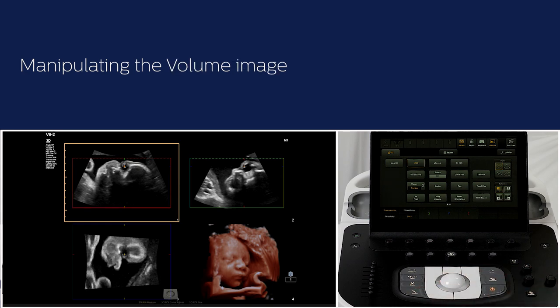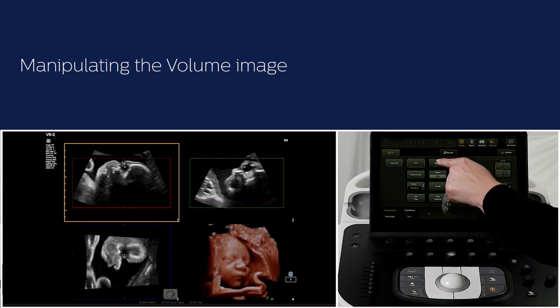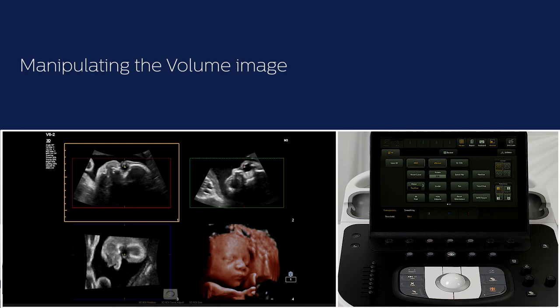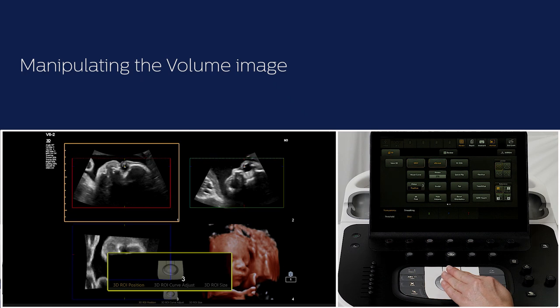Manipulating the volume image: if there are structures obscuring the fetal face, a reveal can be used to automatically remove these structures to get a better view of the fetal face. Optimize the region of interest boxes to see the desired volume image by using the trackball and the buttons next to it to change the region of interest position, size, or curve adjust.